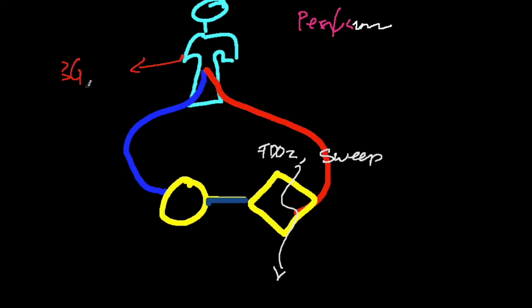The reason is that it is the most proximal blood vessel. And so if this arterial oxygenated blood is making its way up to the arch and perfusing the brain, and the first stop along the way checks out, meaning the right arm, then chances are you're getting really good flow or properly oxygenated blood to the head vessels.